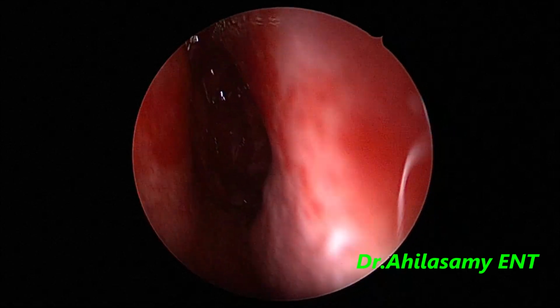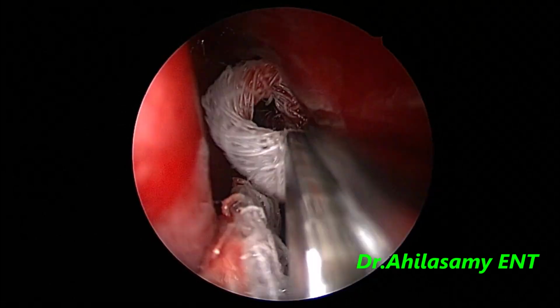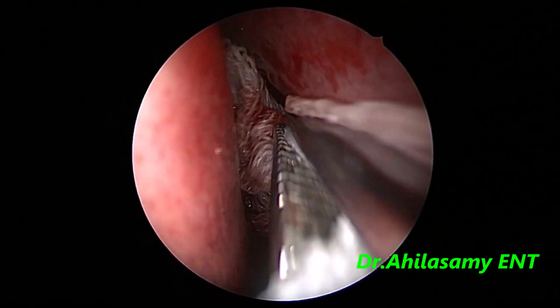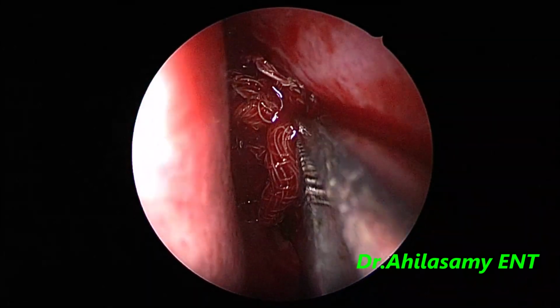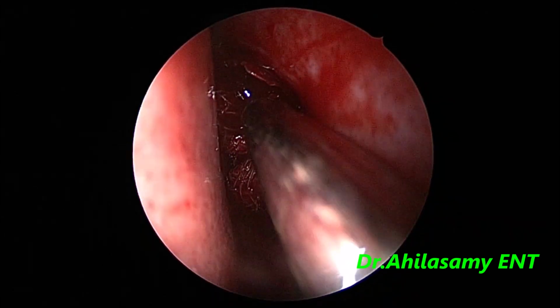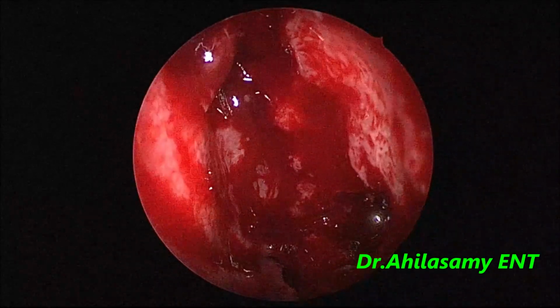Most of the bleeding within the nasal cavity will stop with good packing of roller gauze soaked in 4% xylocaine and adrenaline, and keep it pressed for a couple of minutes. Then take it out, the bleeder will stop. Even a sphenopalatine bleeder will stop.